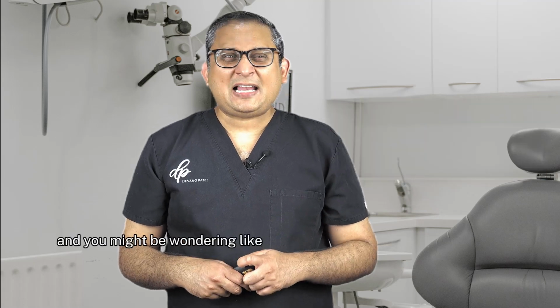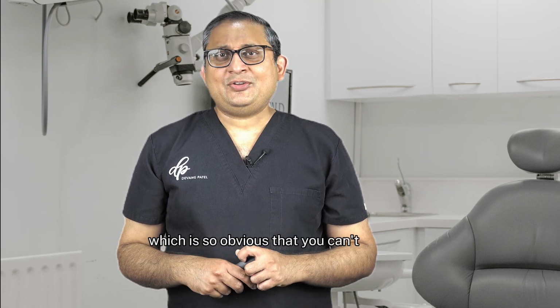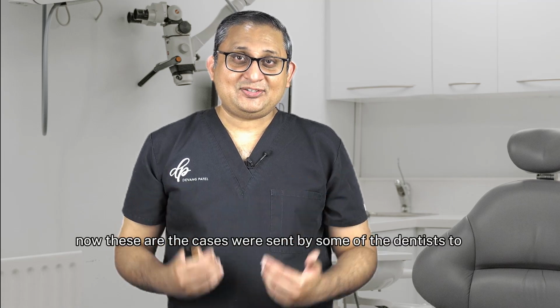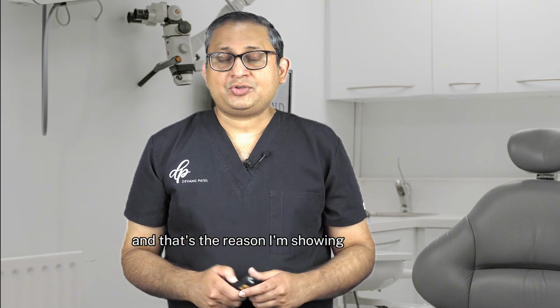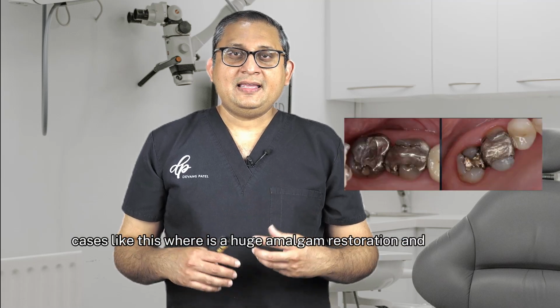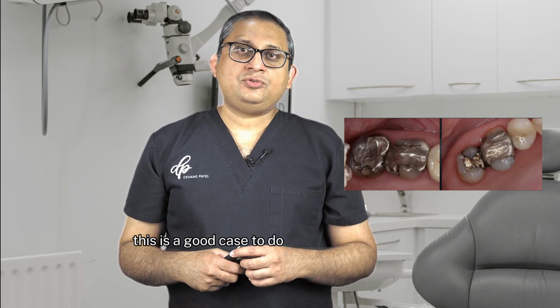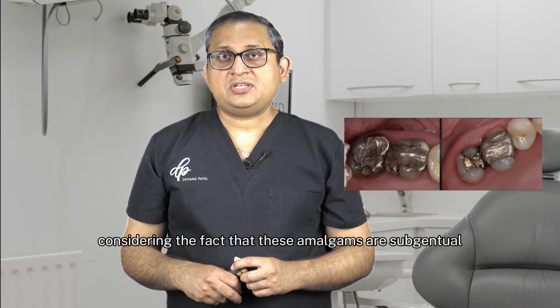And you might be wondering why I'm showing cases which are so obvious that you can't do DME. Now, these cases were sent to me by some dentists asking whether it's possible to do DME or not, and that's the reason I'm showing them to you. Now cases like this, where it's a huge amalgam restoration and you've got some enamel there, are a good case to do deep margin elevation, considering the fact that these amalgams are subgingival.